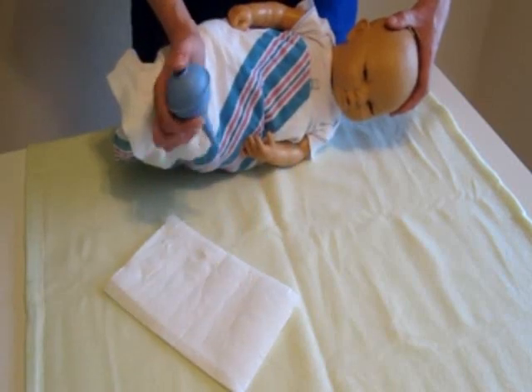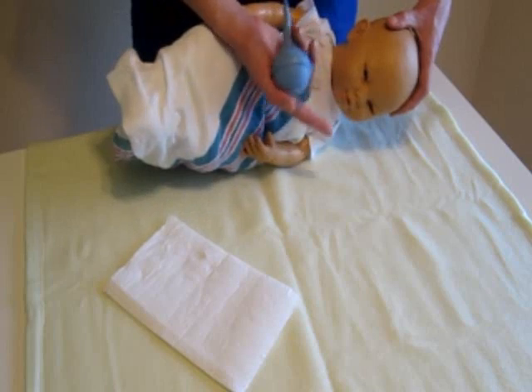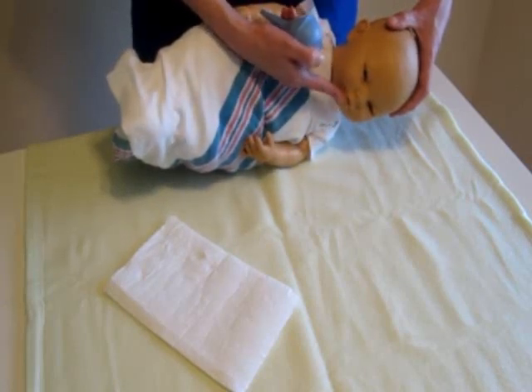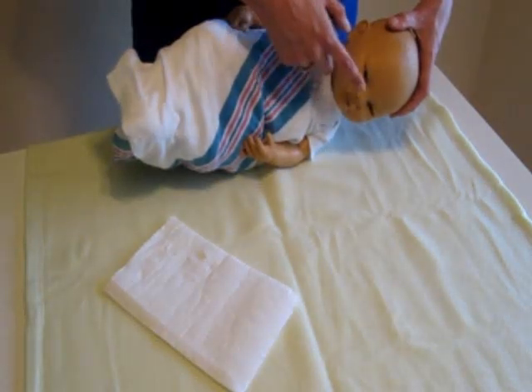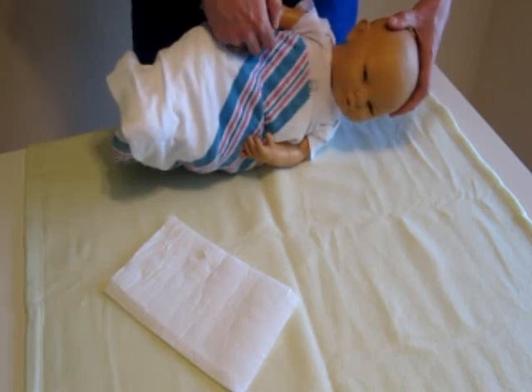Now, if your baby has spit up and there's milk coming out from both the mouth and the nose, suction the mouth first and then suction the nose, so that way you're not bringing any mucus or boogies from the nose into the mouth.